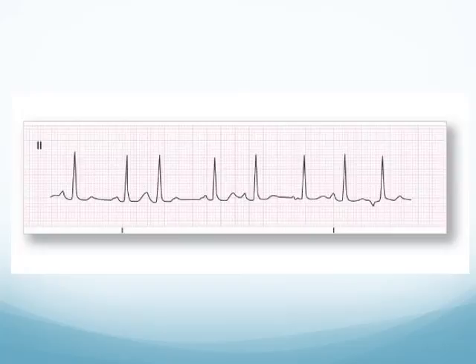We know it's irregular. Now we want to know if it's irregularly irregular or regularly irregular. It appears to me that it's irregularly irregular. There doesn't appear to be any patterns occurring here.